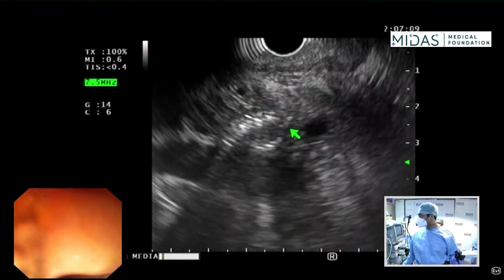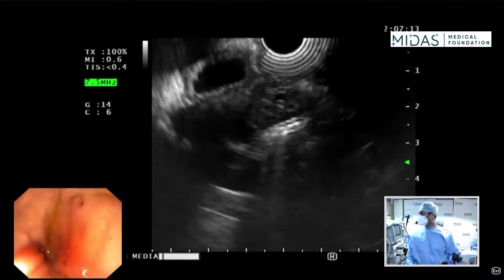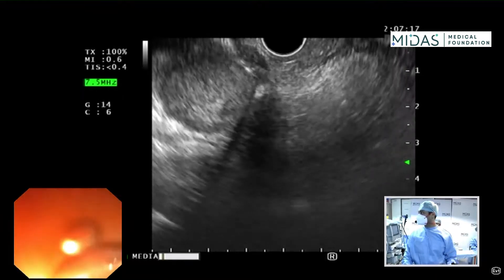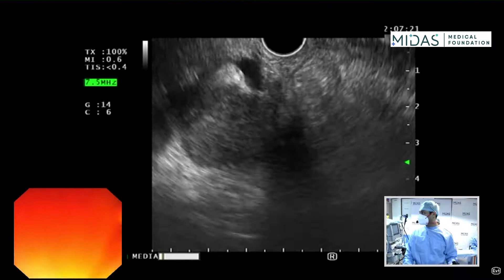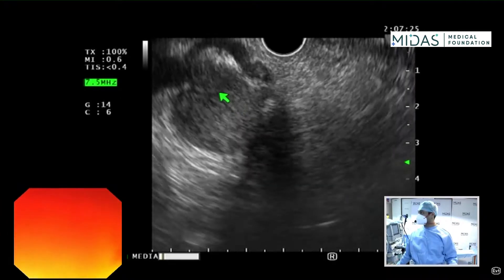We are going to characterize the mass in a second. I'm in the apex of the duodenal bulb here. I'm going to use my big wheel towards me — and actually I can also see a nice lymph node. This is a portal lymph node here; I'll show you on the screen.